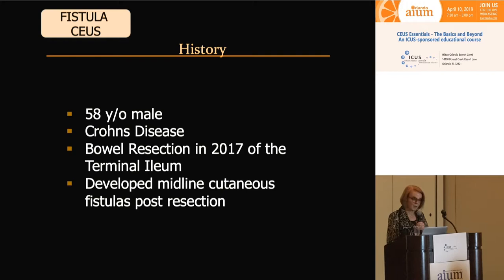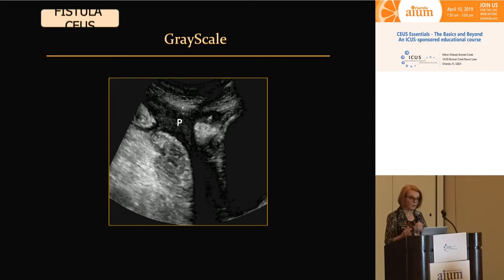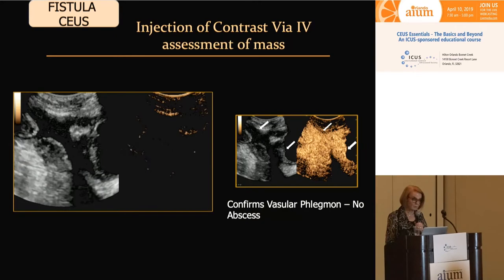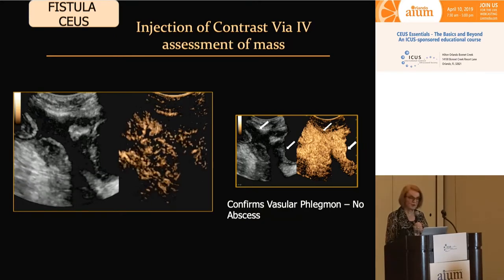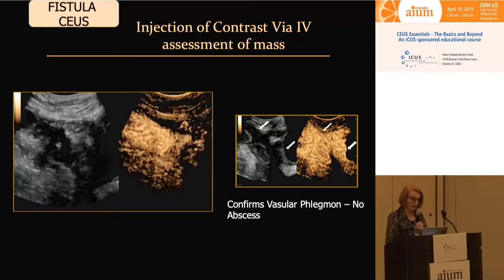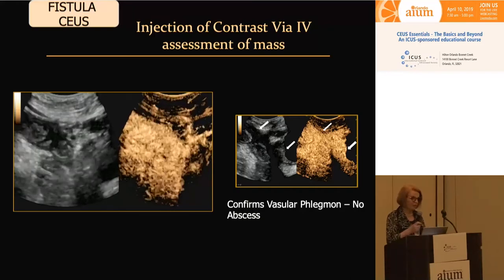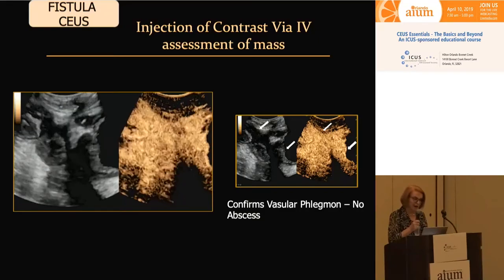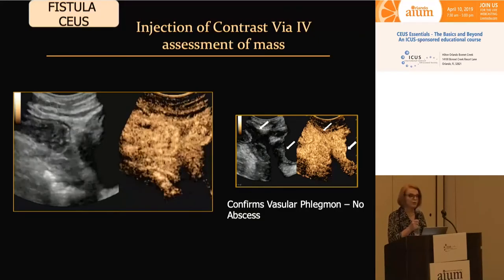Now we'll look at fistula imaging with contrast ultrasound. This is a 58-year-old male with Crohn's disease who had bowel resection in 2017 and developed a midline cutaneous fistula post-resection. Although he had multiple attempts to characterize what was going on, they were somewhat unsuccessful. On grayscale, we're looking in the pelvis — the bladder is on the right side of the image. There's a phlegmonous, hypoechoic mass interdigitating with the fat, labeled P. A failed contrast fistulogram had been performed previously.